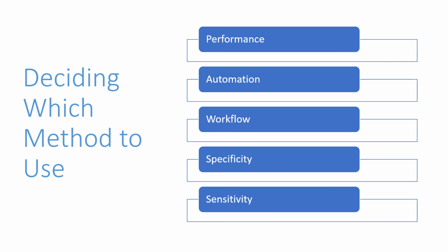A fully automated system processes EIAs in its entirety, only requiring technicians to load the samples. Most MIAs and IIF systems are also fully automated, but for IIFs, a technician is required to validate and approve the machine's results. The three tests also have an impact on workflow.